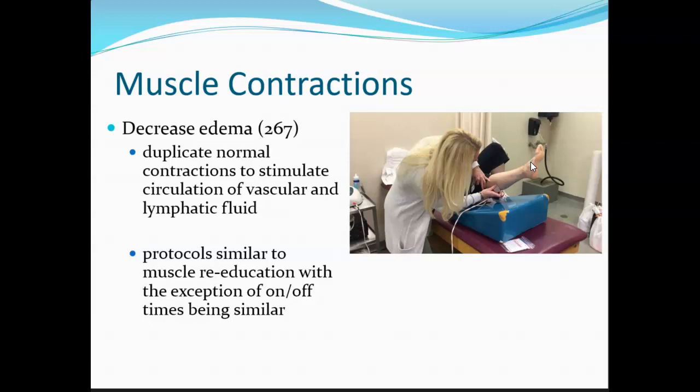We want to do that. We want to contract it. And so if we can just sit there and twitch back and forth, then that's kind of the theory that may help do that. You put them in some elevation, you contract the muscles.